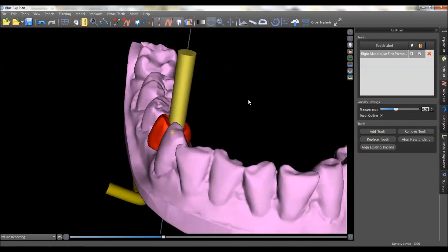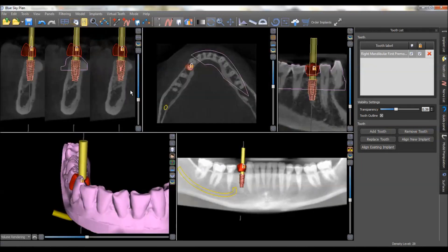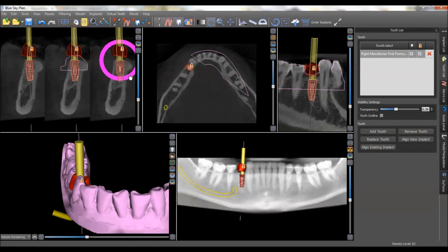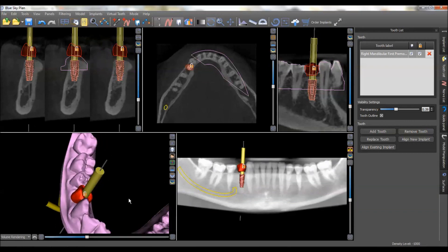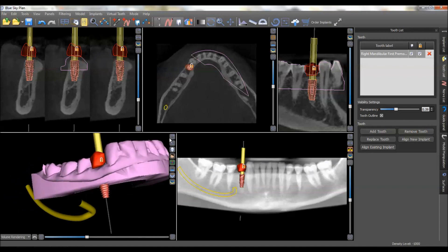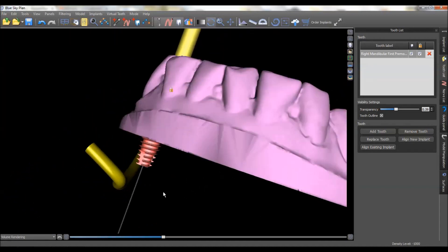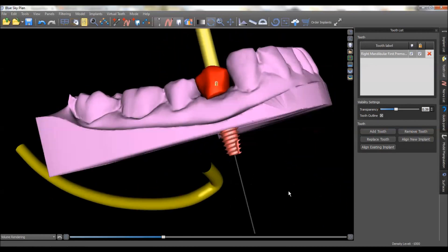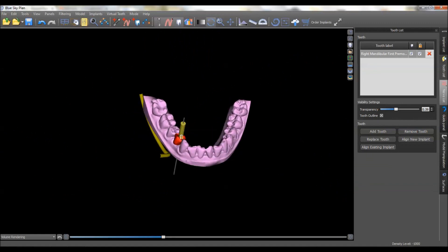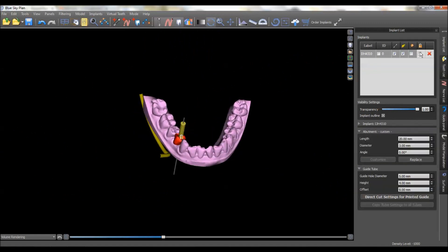I'm happy with that placement — that looks good. You could possibly come a little bit to the buccal with this — I think I like that just a little bit better. Look at it in all dimensions. You can appreciate here how close we'll be to the nerve, which is not too close — I feel very comfortable with that. I'm happy with the implant position, so at this point I would lock that implant position as well.